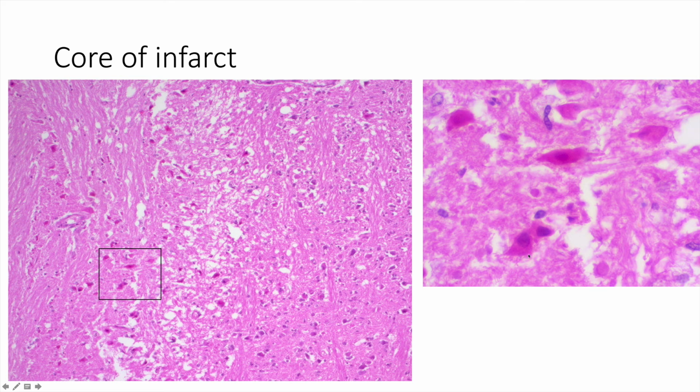They also look reddened, and what's happening here is that the nucleic acid part of the neuron within the nucleus is being lost, and so these neurons are losing their characteristic hematoxylin or blue staining, whereas the cytoplasmic component is not lost as quickly, and so they appear to be red or red neurons, but all of these neurons will succumb to the process.